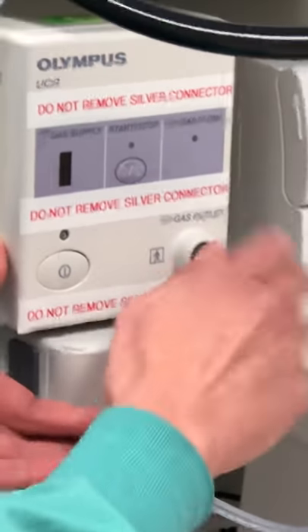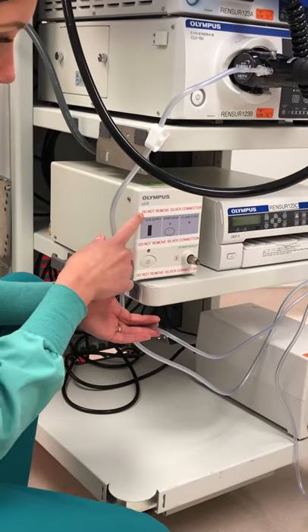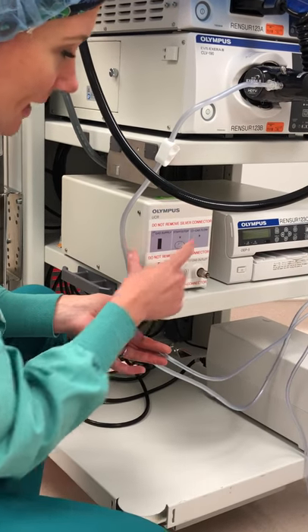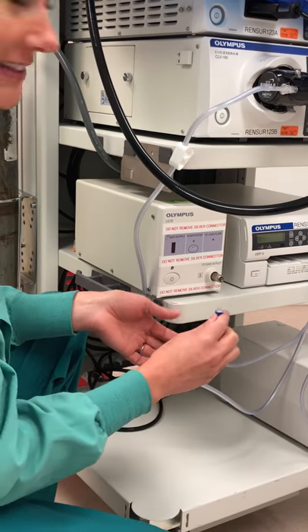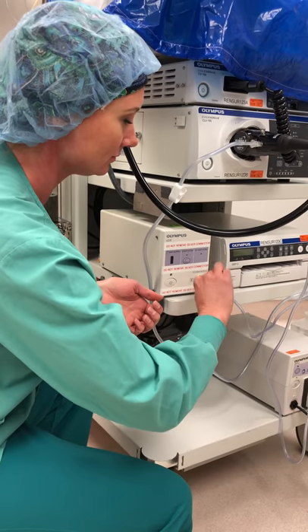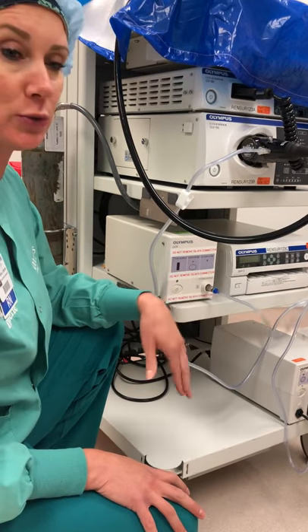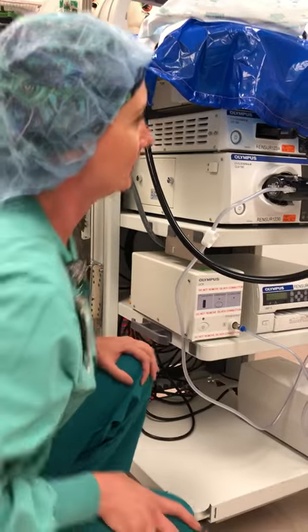These are getting thrown away and we're getting emergency calls to replace them. As you can see, 'do not remove silver connector' is written on here three times. This piece screws right into it, and that is the CO2 insufflator.